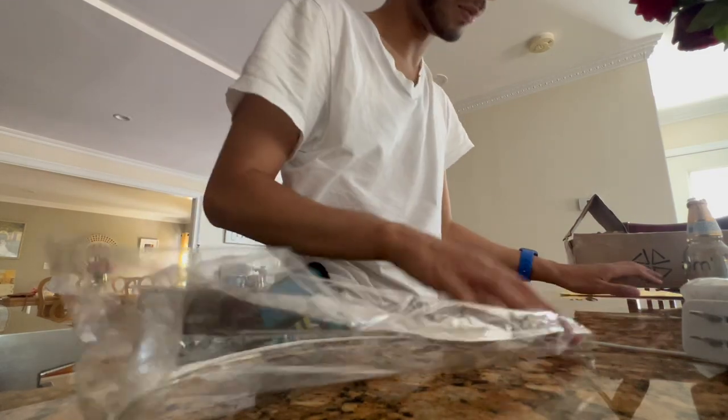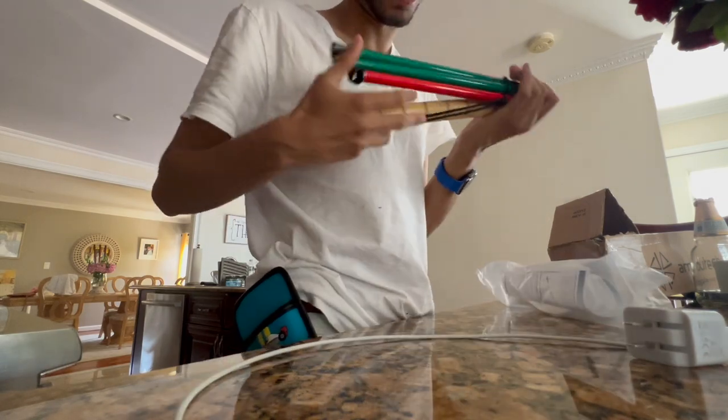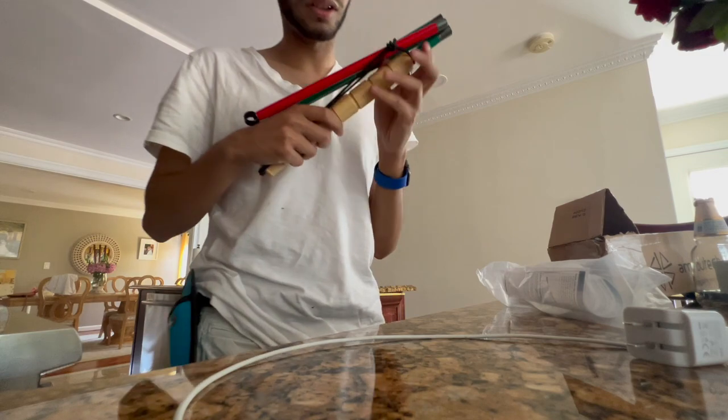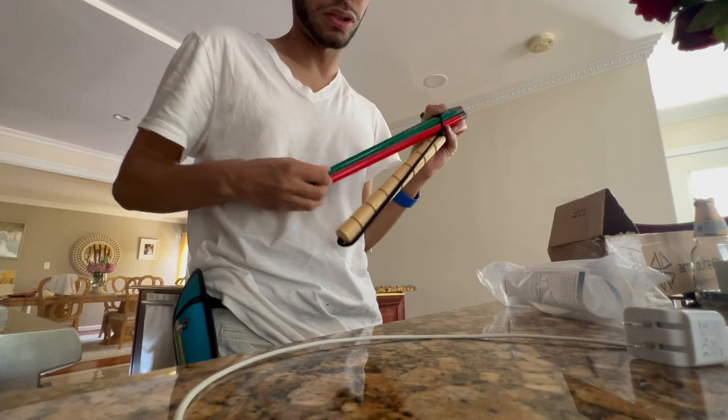I also got a custom cane. A custom cane! Let's open this up. A wood handle. And I have no tip, but I have tips on the way. This is awesome, dude.